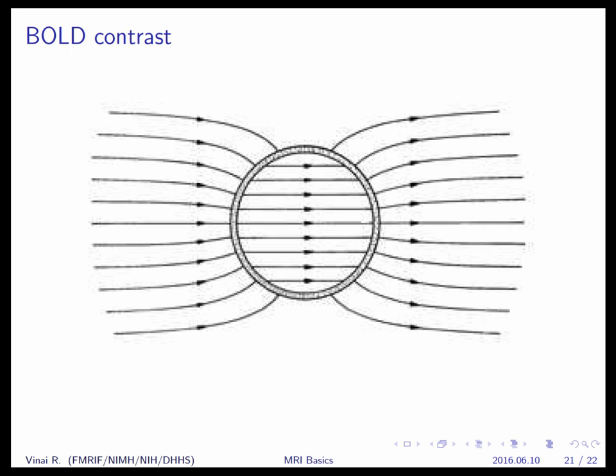So for T2 star, does that mean that they're faster? So that they're going more quickly? So for T2 star, this is what we term a gradient echo type of scan with a long echo. So it means that for the type of readout, we don't do any kind of refocusing except maybe with gradients. So these are the imaging gradients that I talked about a little bit earlier in terms of how you localize and also use for reading out. So by using those gradients appropriately, we weight the imaging sequence and the data that you collect towards T2 star.